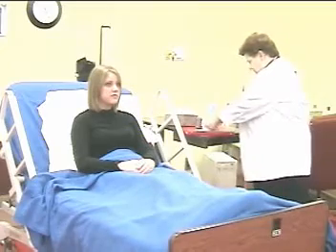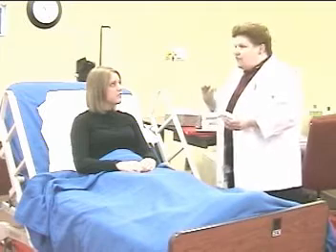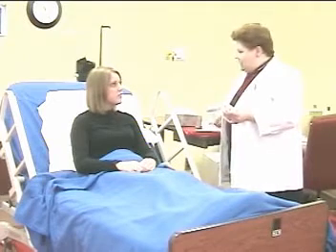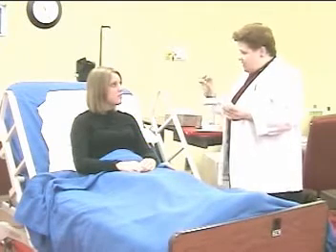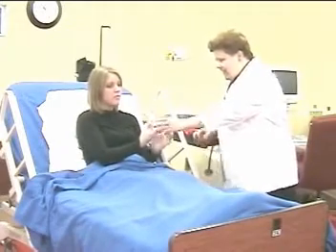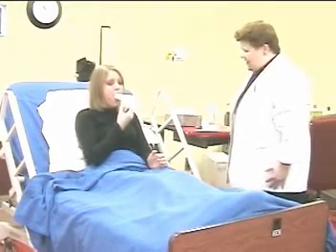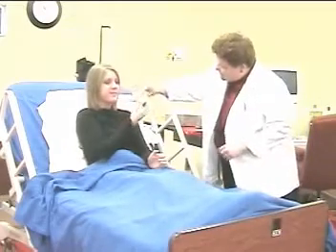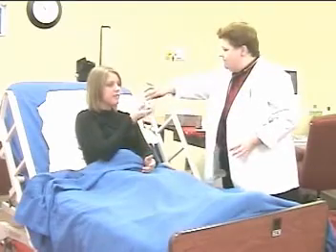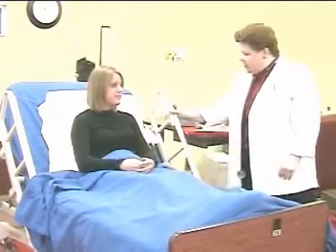Measures expiratory peak flow prior to therapy. One of the things we like to have people do is take a deep breath in and blow into this device. It's called the peak flow meter and it will help us tell how large your airways are, how open your lungs are. Take a nice deep breath in, put your mouth around the mouthpiece and explode that air out. Excellent. Typically would repeat it several times — one more time. That was even better than the first time.